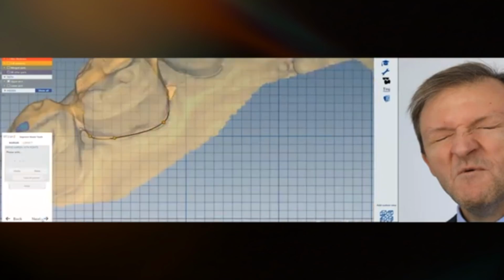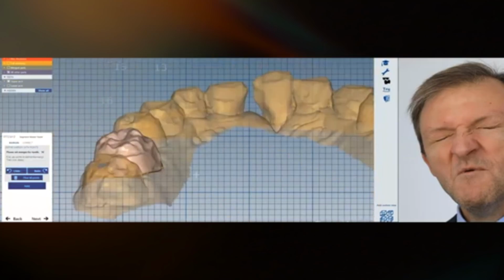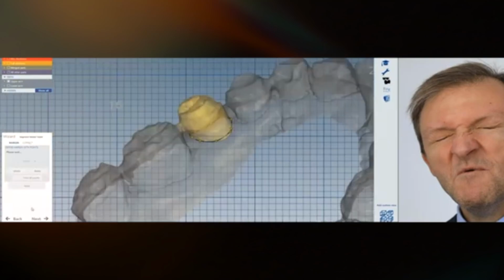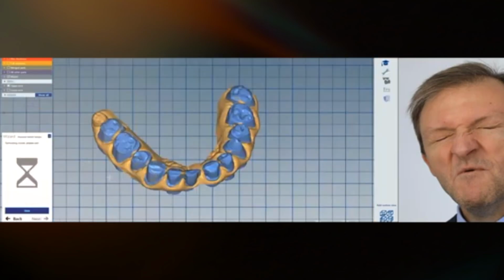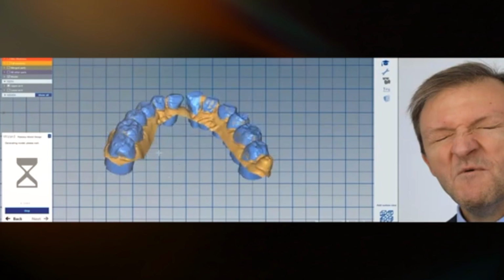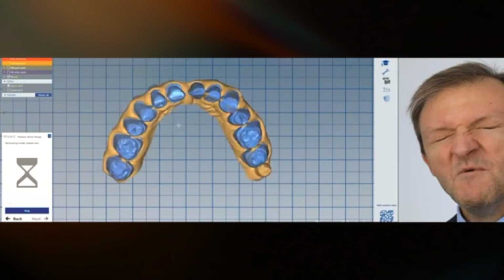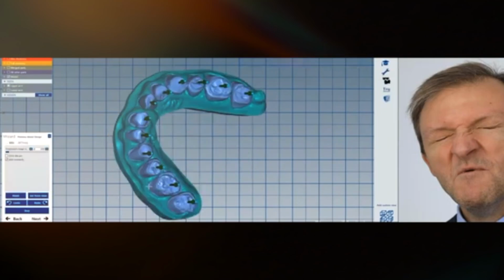We do both works at the same time. So we proceed for the alveolar model, with the insertion paths of the dies, alveolar dies.